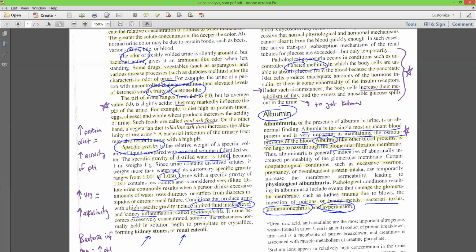Okay, so that must be taken within a few minutes after void, after they urinate in a special cup. If you want to get the most accurate pH, it needs to be done within a couple of minutes, because the longer the urine sits there, the more the pH changes just by simply sitting there.